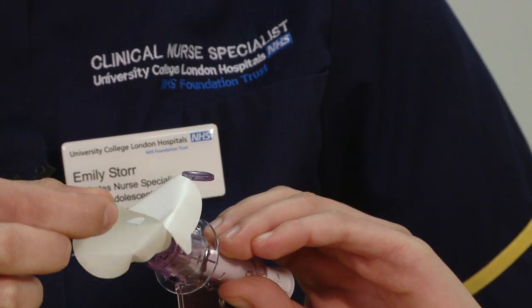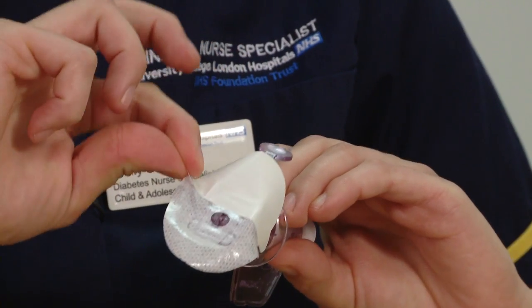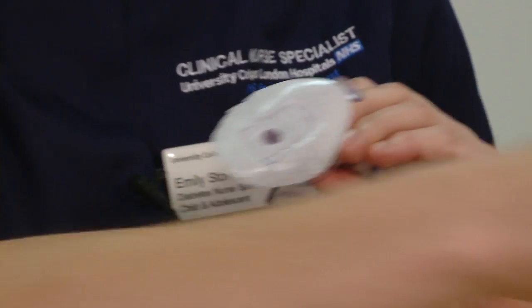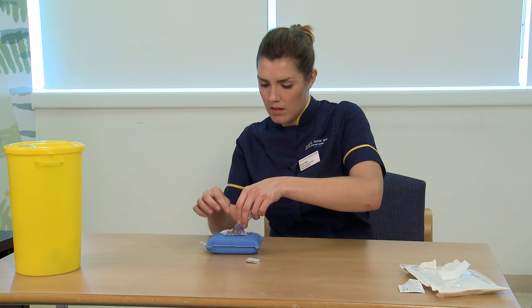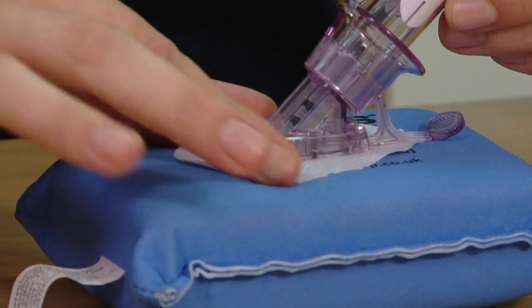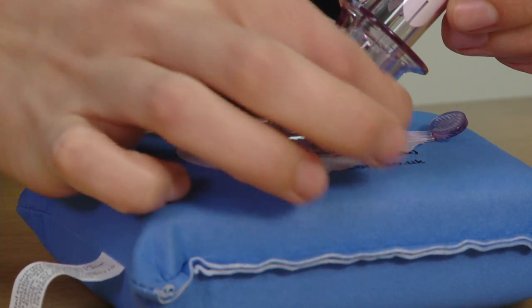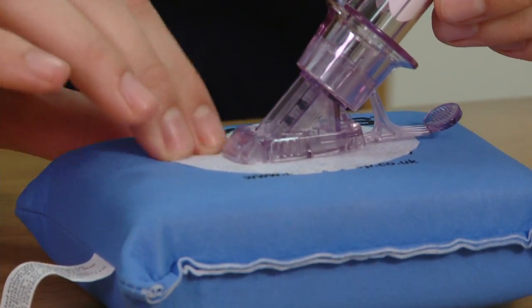The first thing I need to do is remove the adhesive backing from the sticky tape, and then place that horizontally onto the skin. I need to ensure that the sticky tape is stuck down securely. When you attach the sensor to the tummy, you need to make sure it's at least three inches away from your insulin pump cannula.